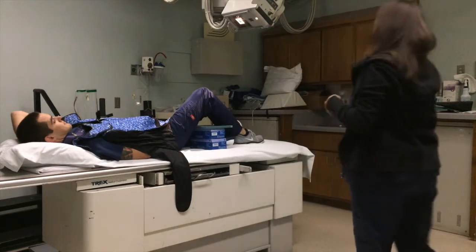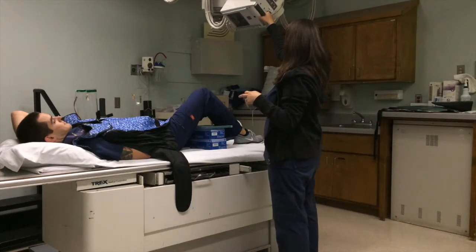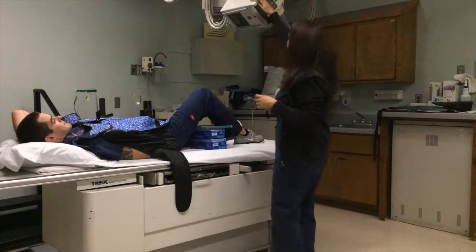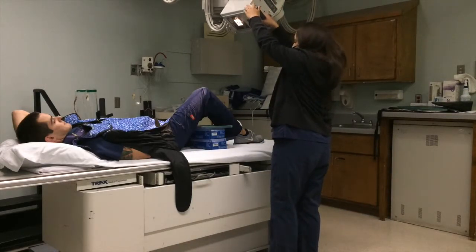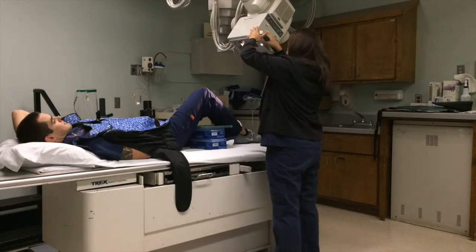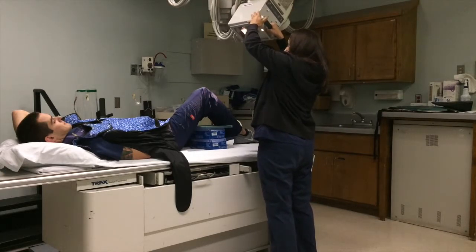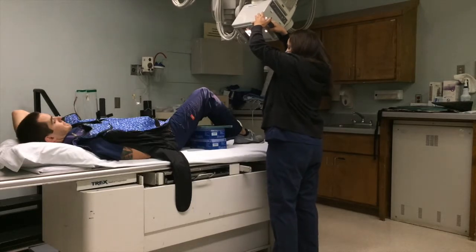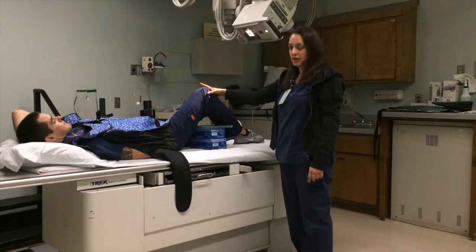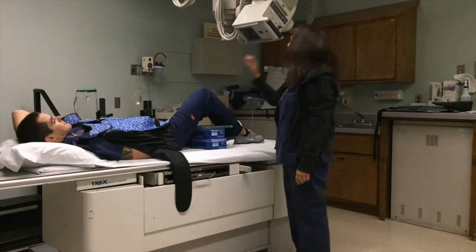I'm going to step back and look. I'm going to do a little more. I like that. Okay, so I'm going to bring it down a little bit. Make sure I have my distance. I don't want to get too close. That looks better. I like that distance. All right, so here is my central ray. I'm going to go between the epicondyles, and about right below the apex of the patella.